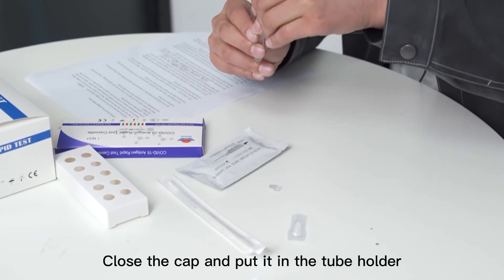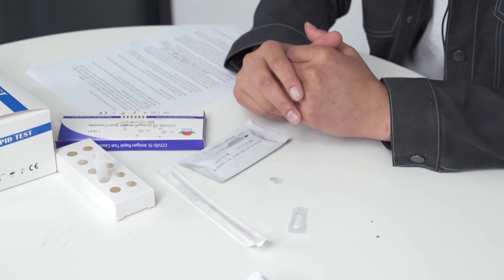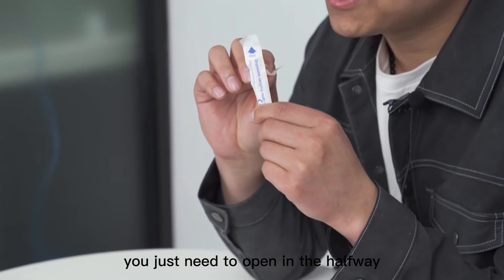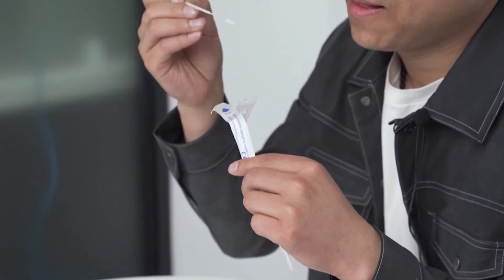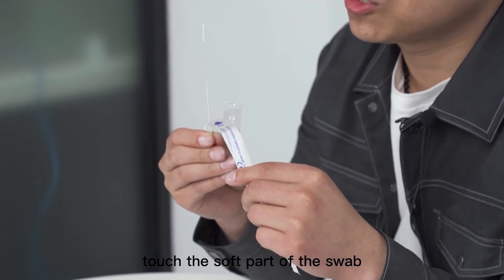Close the cap and put it in the tube holder. Then we need to take the swab from the package. There is a little opening here — you just need to open it halfway and take it out like this. Please make sure you do not touch the soft part of the swab.